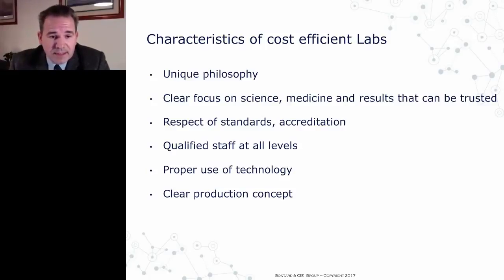Third aspect is the respect of standards and accreditation. If you have a group of laboratories with multiple production sites and you're in the process of accreditation and you have multiple platforms, it might become a nightmare to standardize and to get a proper accreditation. And when somebody asks you, what is your percentage of accreditation, you have a difficult time answering. And in some cases, you give numbers that are not valid. And when you know that accreditation is going to be one of the key elements for reimbursement level, you better have something that is solid.